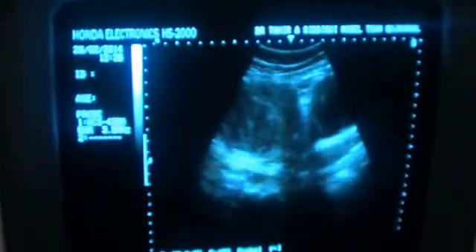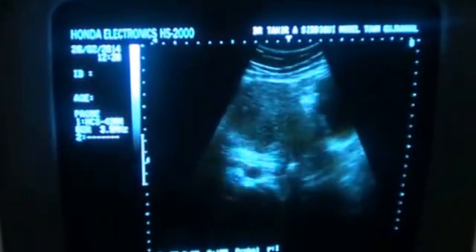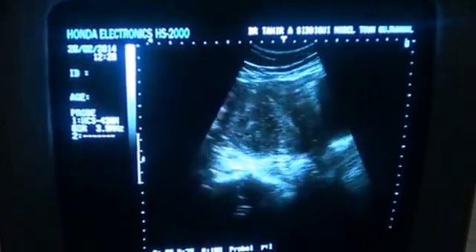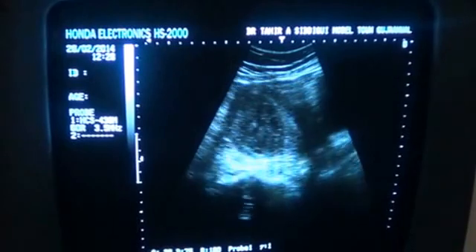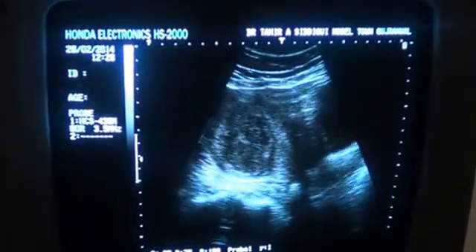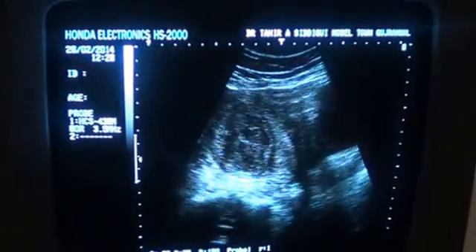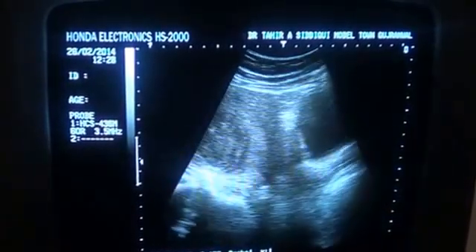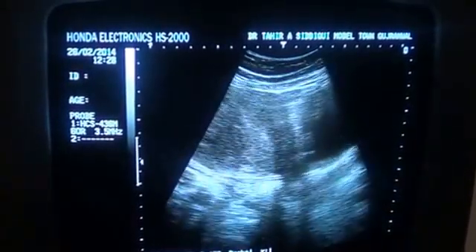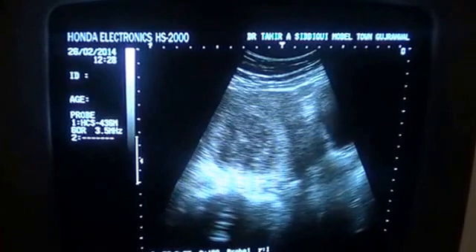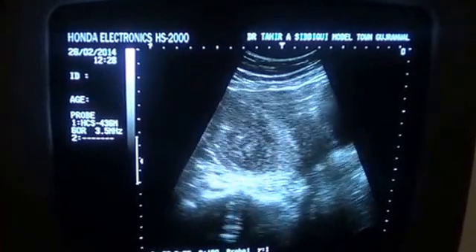This is the pelvic ultrasound of a 38-year-old female. You are seeing the longitudinal section of the pelvis in which you are seeing the urinary bladder and the anterior myometrium.